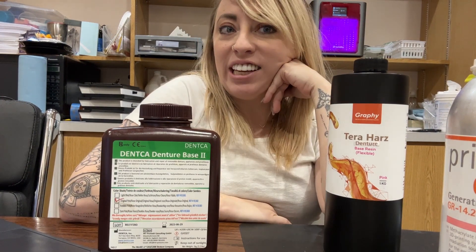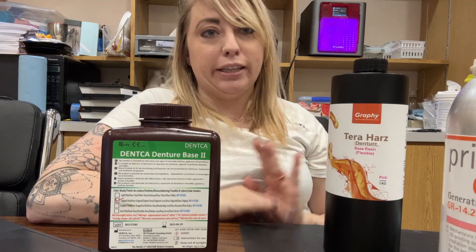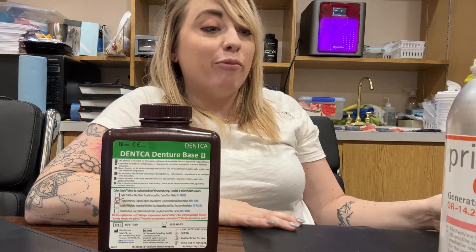Hey guys, Chelsea Holmeyer here, the digital dental assistant. I just wanted to go over some of our denture and partial 3D print materials that we use, why we like them and don't like them, and all that good stuff.